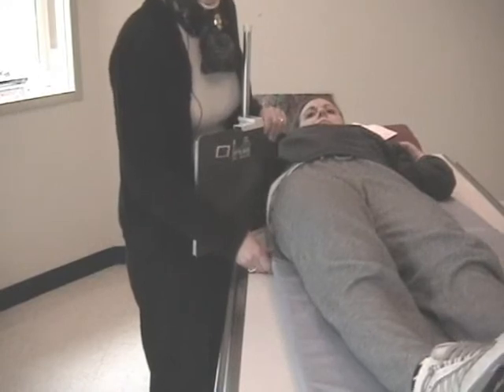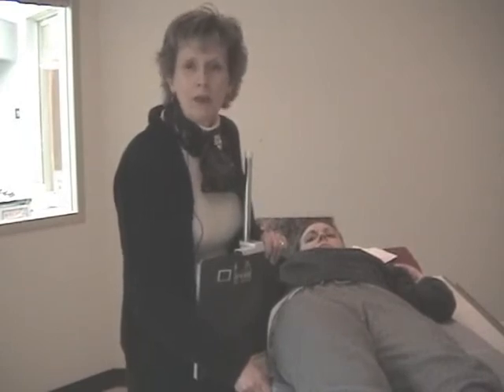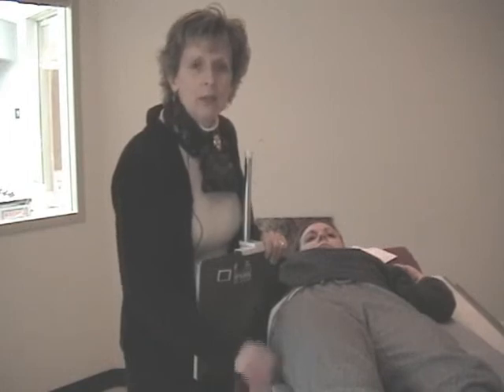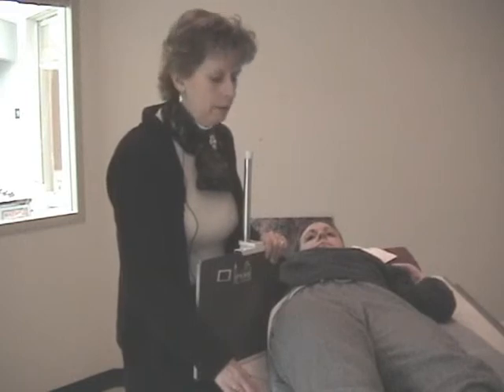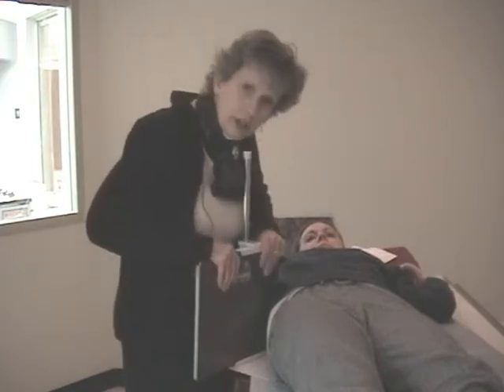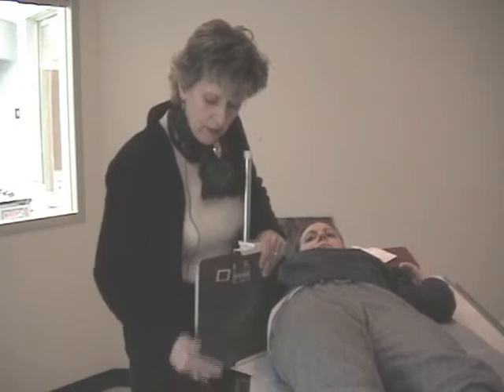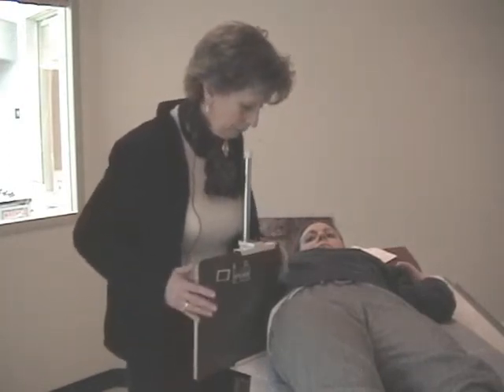And beginning students, I want you to build everybody up until you get to the point where you can judge body habitus. Somebody who's 300 pounds, of course, is going to have a lot of adipose tissue. The bone won't be resting so close to the table, and you won't need to build them up on a sponge. This patient might be on a stretcher. If they're on a stretcher, just push the cassette down, recognizing that this edge of the film must go lower, must be more posterior to that patient.